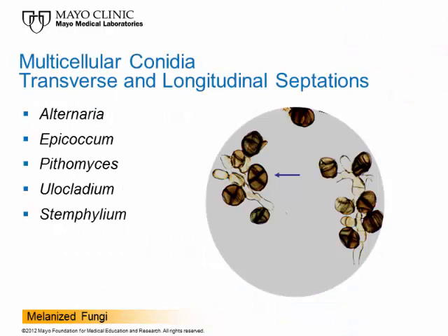We're going to look at a group of fungi that produce multicellular conidia — not just single cells. They are cells that are multicellular conidia with transverse and longitudinal septations within them. On the right-hand side where the arrow is, you can see septations within that pigmented cell going both directions. To the left of that cell at 9 o'clock, you'll see both horizontal and longitudinal septations within that spore or conidium.